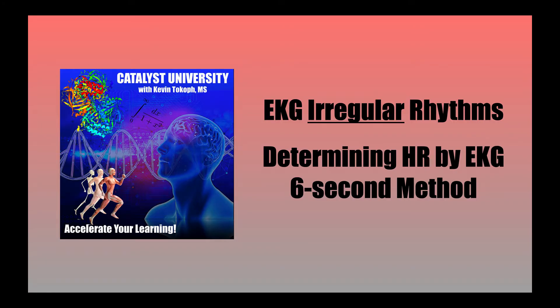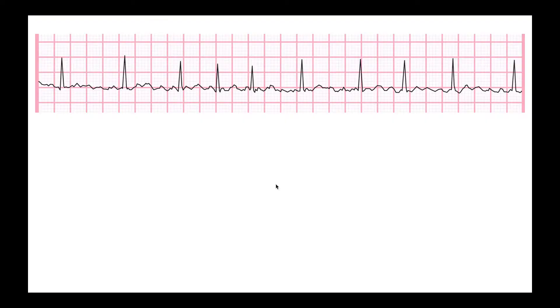But when we have an irregular rhythm, all bets are off and we have to use a different method. This method is sometimes called the six-second method. We're going to talk about how you do that in this video. Here's our EKG pattern right here. This is actually atrial fibrillation, which is pretty much 100% of the time irregular.